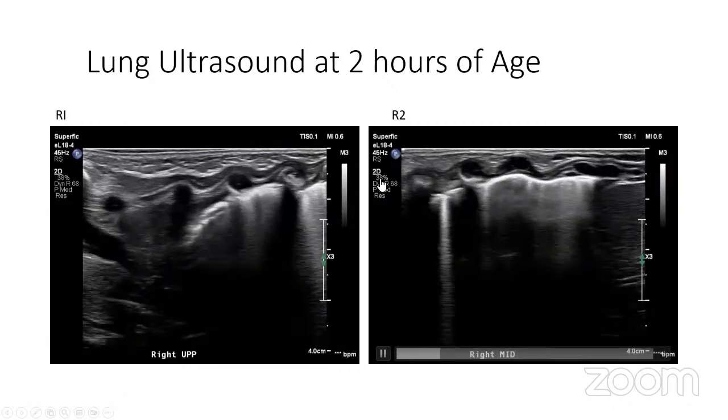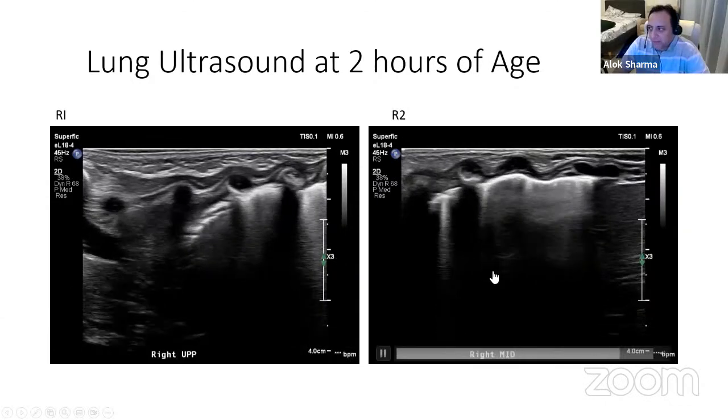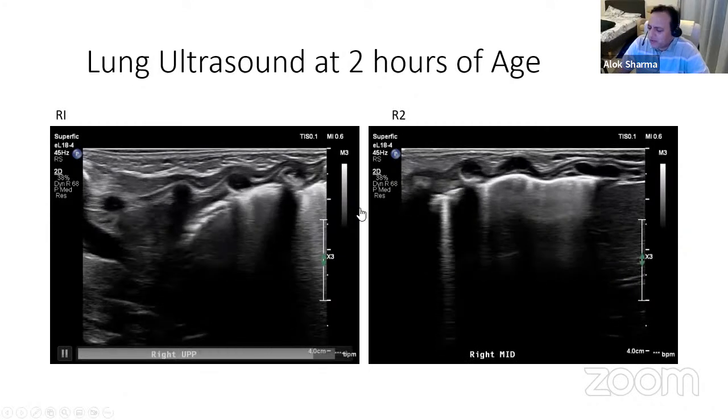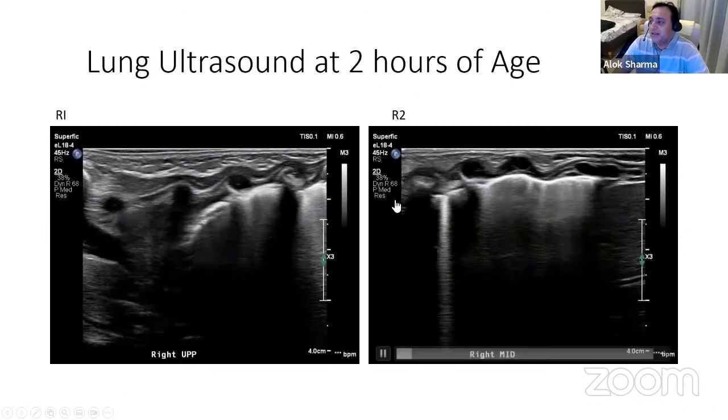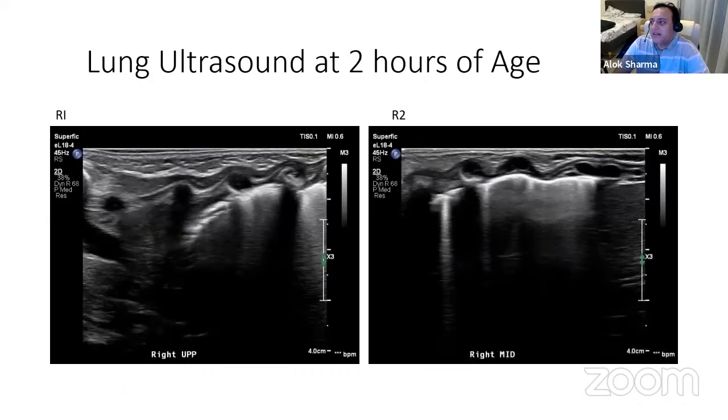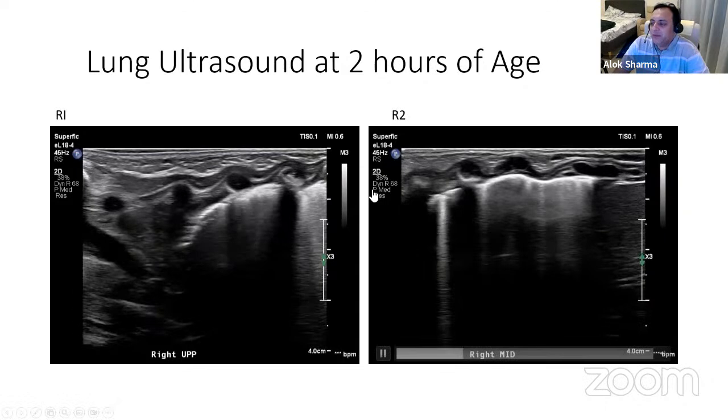So what do you think? My gain is only 38%. My view is that the gain can be much better in these images, and can be much higher. I promise you, I will show you the good images I've taken as well. But I think 38% should probably go up to about 68 or 70. The other thing is I'm using medium resolution.